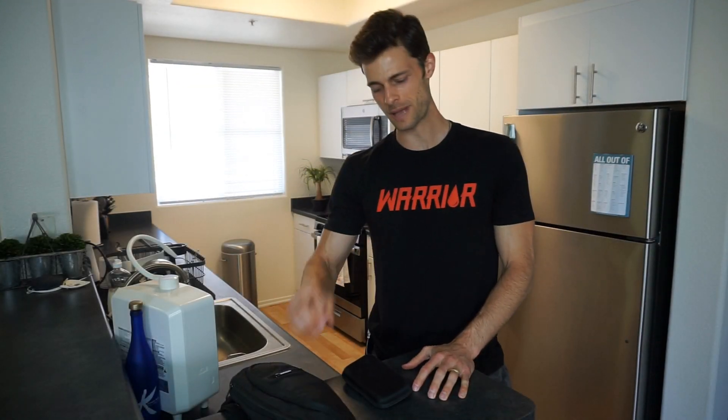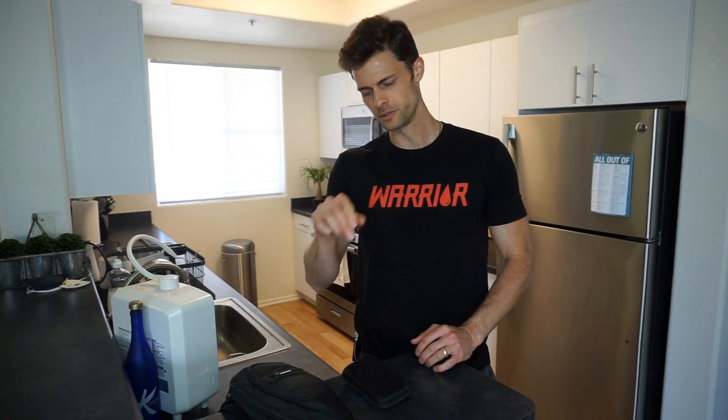My name is Matt and today I want to show you how to test, check, or measure your blood sugar with your fingers. We're going to use a glucometer today. There are many options out there on how you can measure your blood sugars, but today we're going to use a glucometer. I'm going to show you what that looks like, how to test, and even how to change your lancet.